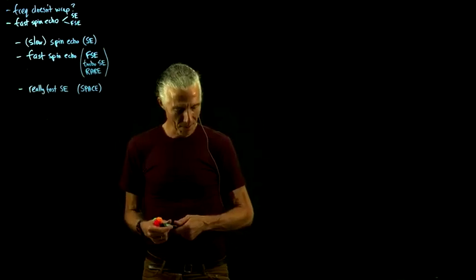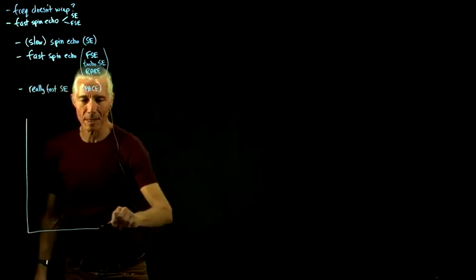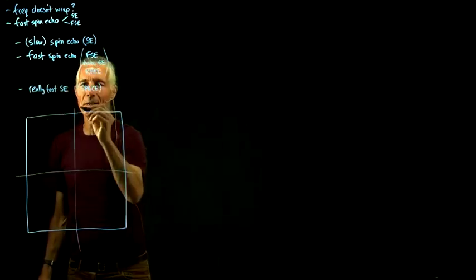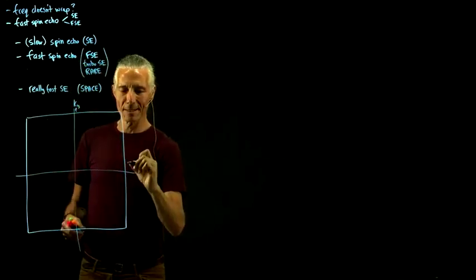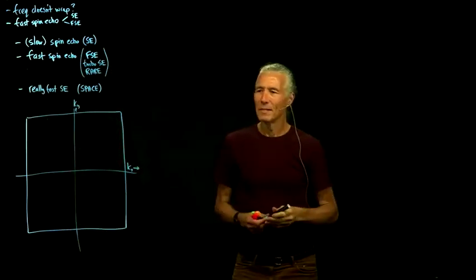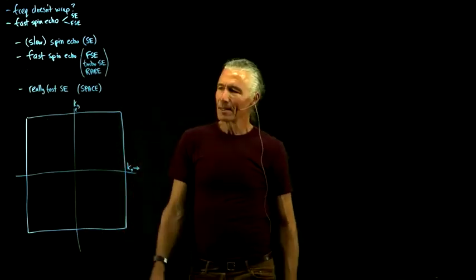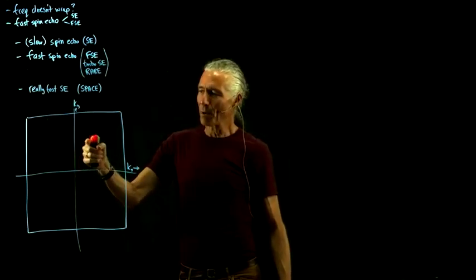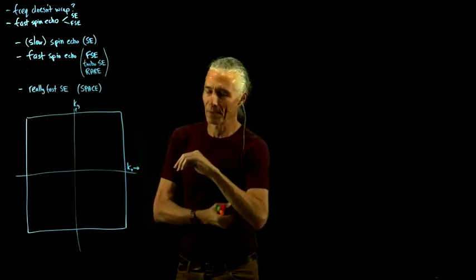So the plan is, over here we'll look at where we are in k-space. So this is our k-space. That's the ky direction, the horizontal stripe direction, and this is the kx direction, the vertical stripe direction, and the intermediate directions are tilted stripe directions. This is the way people typically think of it, but remember, a particular point in this space corresponds to some distribution of spin phase stripes across the actual brain.